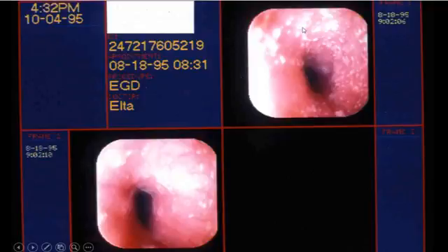And in really immunocompromised patients, untreated AIDS patients, you are likely to see more than one infection. So just because you find a viral inclusion for herpes doesn't mean you can stop looking for CMV or stop looking for Candida, because I've had several cases with all three.